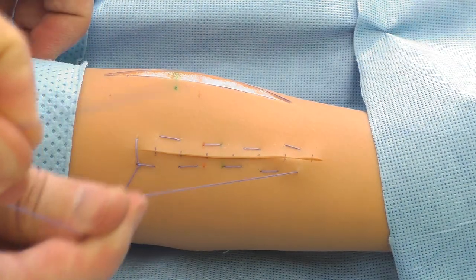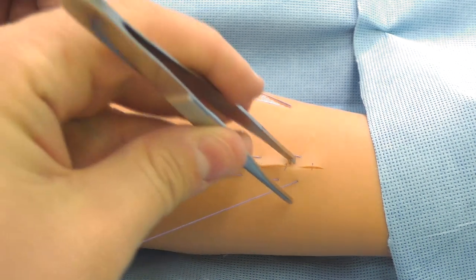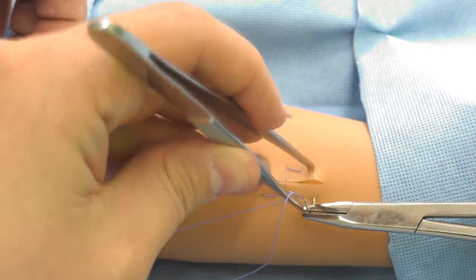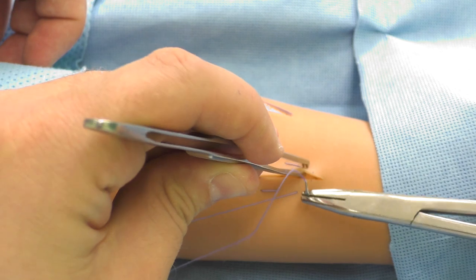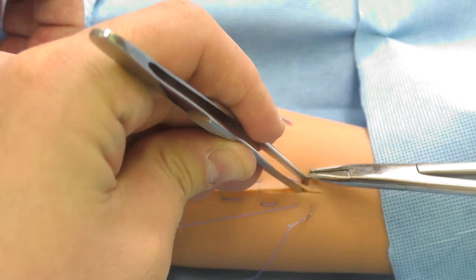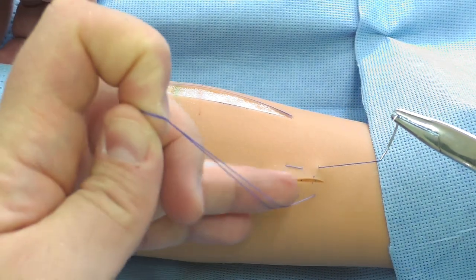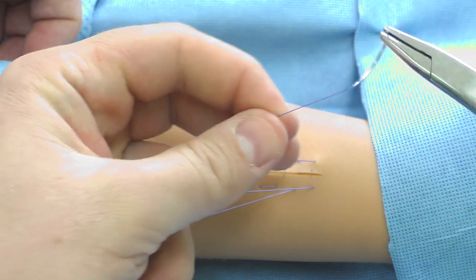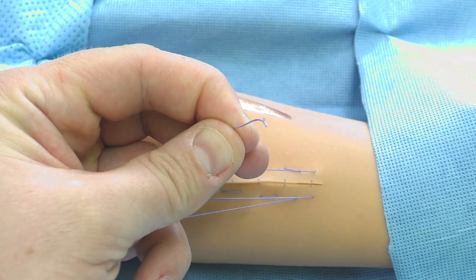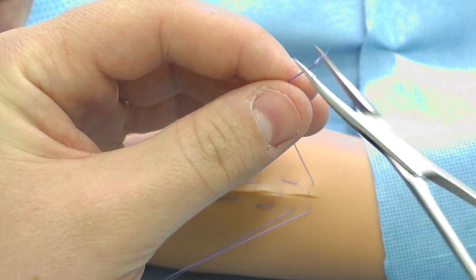The last fixing knot is made in the following way. The previous suture stitch is not completely tightened. The half of a free filament end is threaded under it so that the double end will appear on the one part and on the other, the single one.